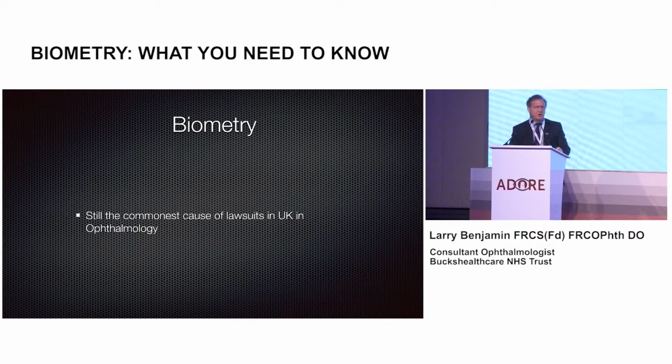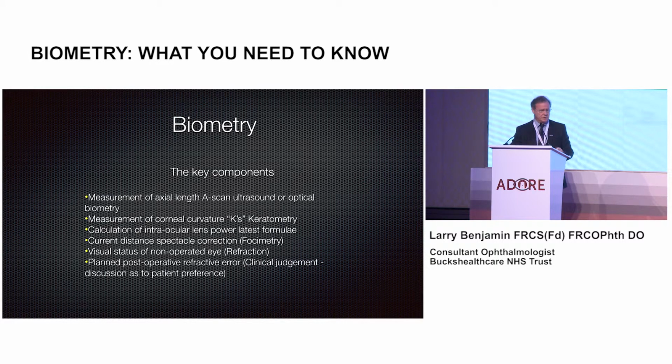And this is still the commonest cause of lawsuits in the United Kingdom in ophthalmology. So someone like me is more likely to be sued for a poor outcome in cataract surgery because of poor biometry than in anything else. So it's an important topic. So it is important that we know these key components.